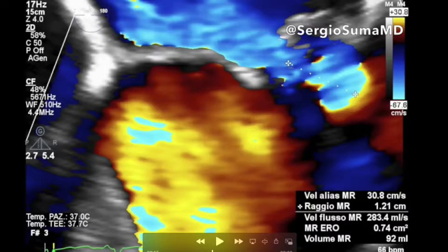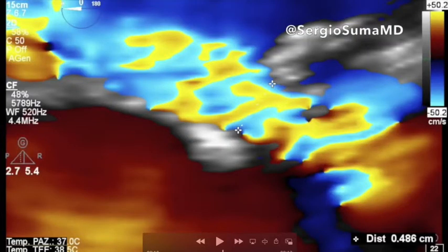The ERO is 0.74 square centimeters and the regurgitation volume is 92. The 2D vena contracta is 0.48 centimeters.